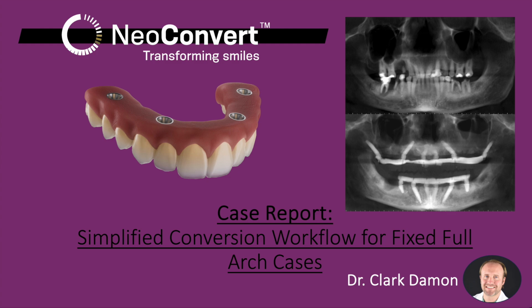Hi there, I'm Dr. Clark Damon, and I want to present to you a simple Neoconvert case that we did in our office. Neoconvert is a simplified conversion workflow for fixed full arch cases. So let's begin.